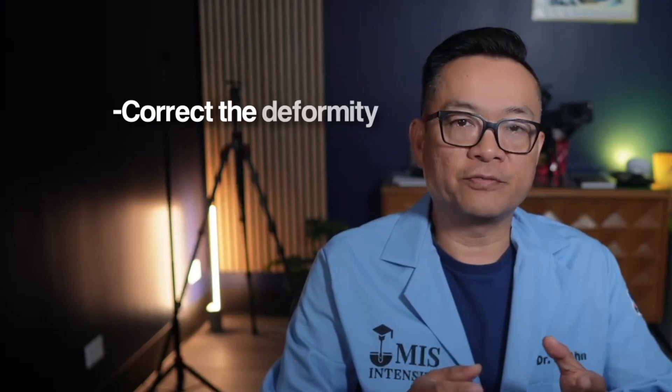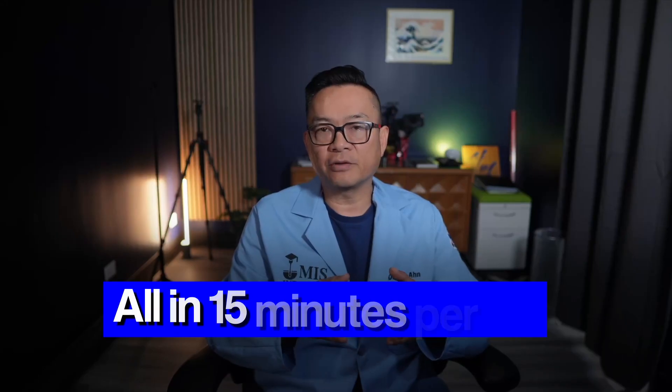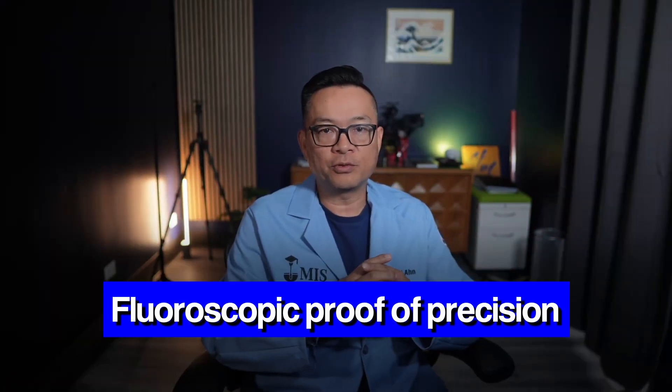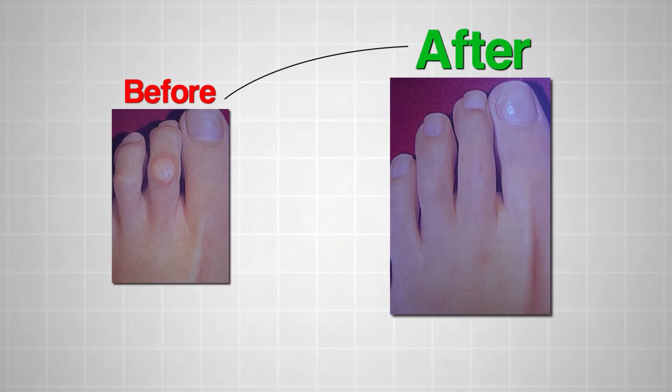Now I can correct the deformity, preserve the joint, and do it all in-office in about 15 minutes per toe. Today I'm going to show you exactly what that looks like — from cadaver lab footage that I teach in my cadaver lab small group workshop, to sawbone simulation, to fluoroscopic proof of precision, to actual cadaver demonstration, and more importantly, the real-world results and the evidence behind it.